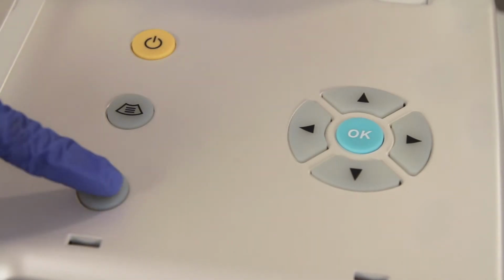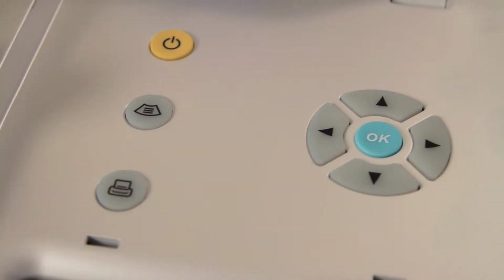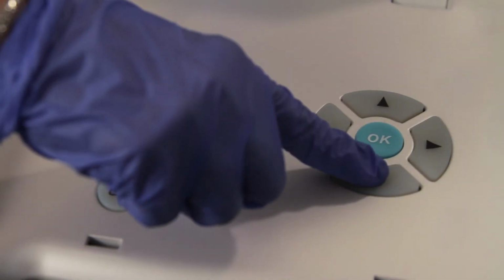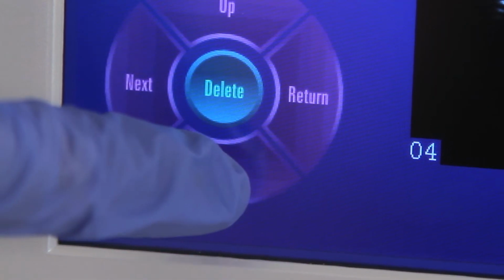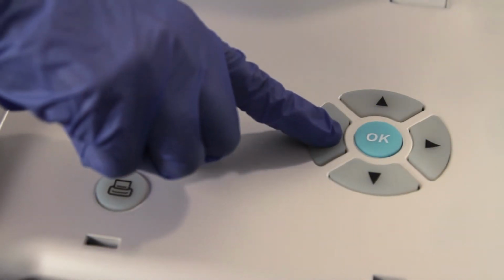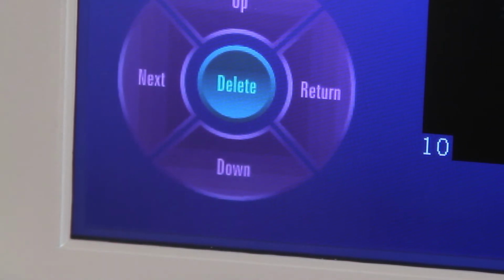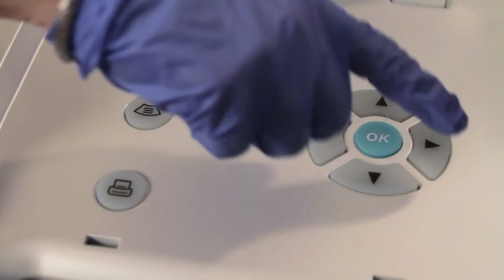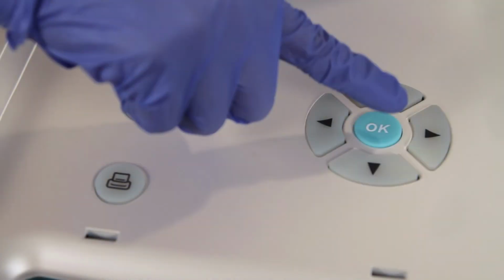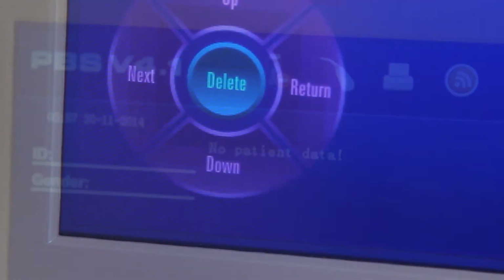Press the printer key to print the current record being displayed. Press the up directional key or touch the up functional key to display the previous record. Press the down directional key or touch the down functional key to display the next record. Press the left directional key or touch the next functional key to display the next 6 images. Press the right directional key or touch the return functional key to return to the ready screen. Press the OK key or touch the delete functional key to delete the current record.